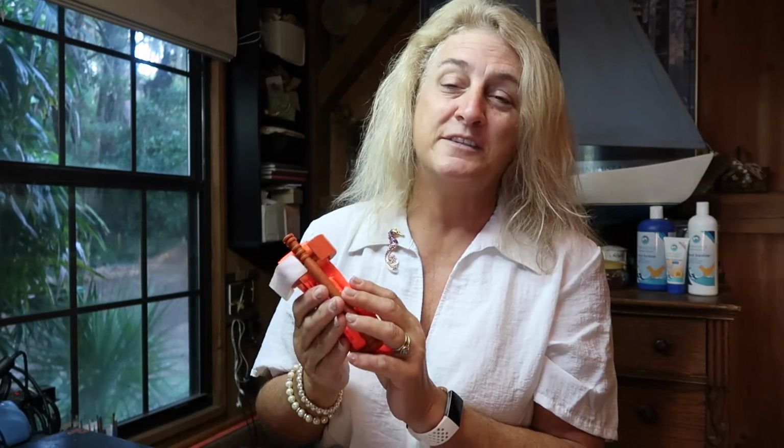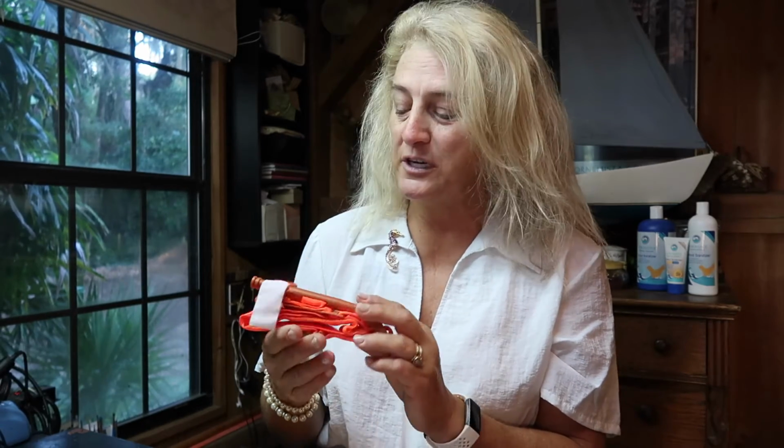Most likely you're going to get to a medical facility by 4 hours, and the only person who's going to unwind this and take it off is somebody with a whole lot of initials after their name, bright lights, cold steel, in the hospital. That is the medical professional who's going to take it off. You as a bystander are simply going to apply it and make sure that the bleeding stops.